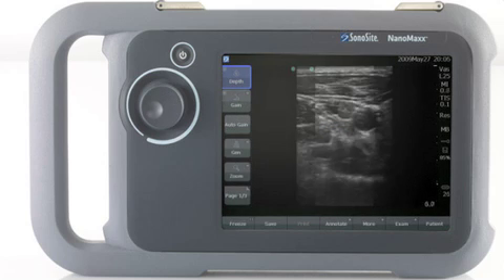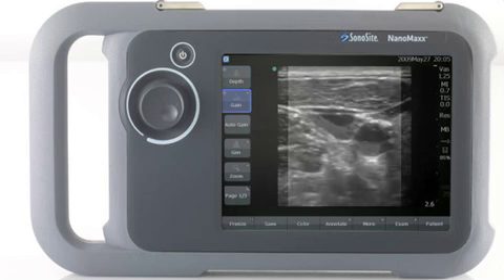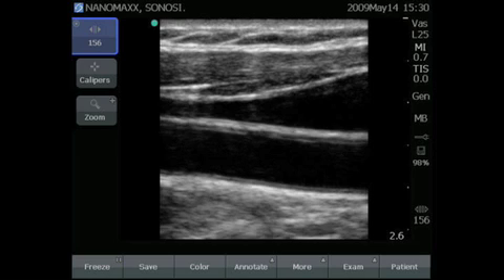You get a great image with only minimal effort. With a single control, the clinician can optimize the resolution, depth, and gain of an image. The on-screen touch buttons are much larger in scale than physical keys, making them easier to activate.